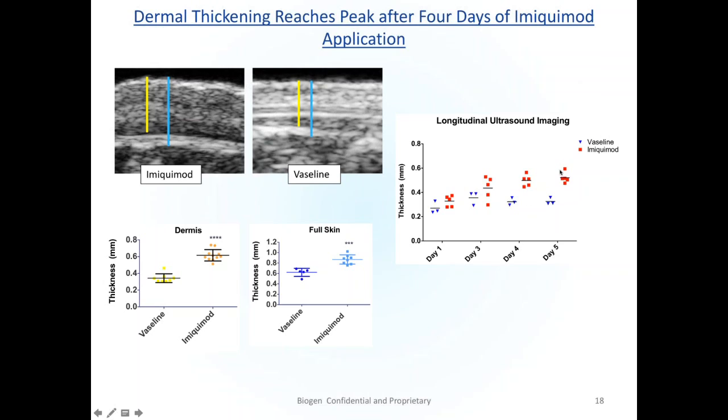So typically, the skin was often collected for this model on day 5, but we were actually able to see that you could get some indications even a little bit earlier as to where these changes were happening. So the context of this model was that the group that we were working with was testing a number of compounds which were potentially inhibiting part of the processes that lead to this inflammation.